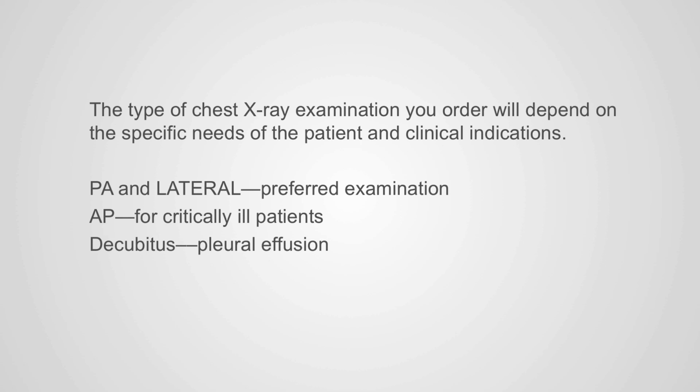The decubitus view is ordered for patients with suspected pleural effusion and differentiating pleural effusion from pleural thickening and pleural tumors. Lordotic view is ordered in order to eliminate overlap of bony structures with the lung apices. Expiration view is ordered when a pneumothorax is suspected.